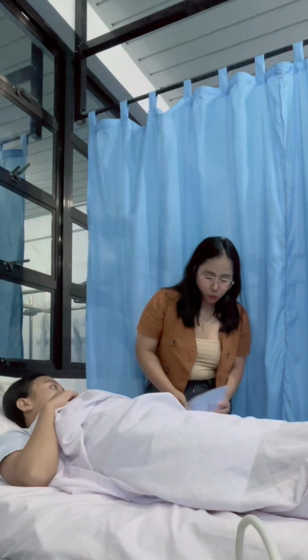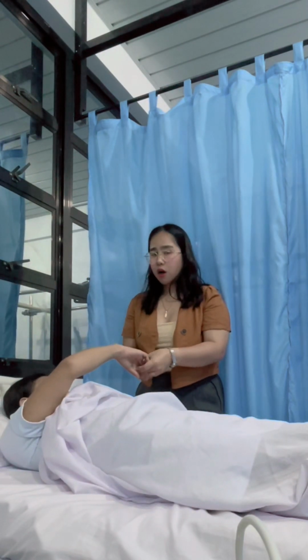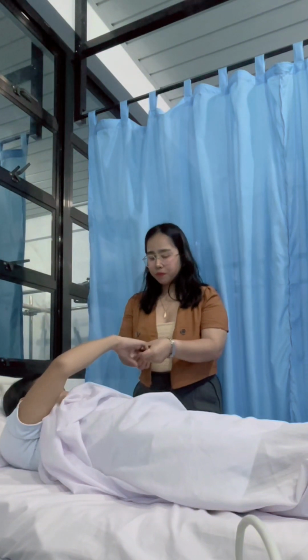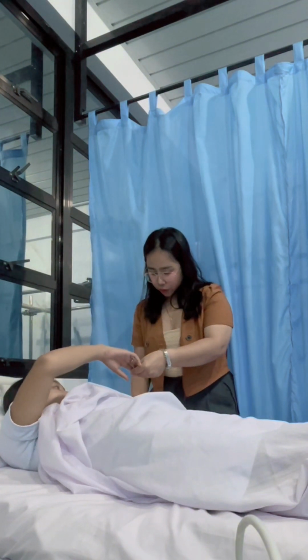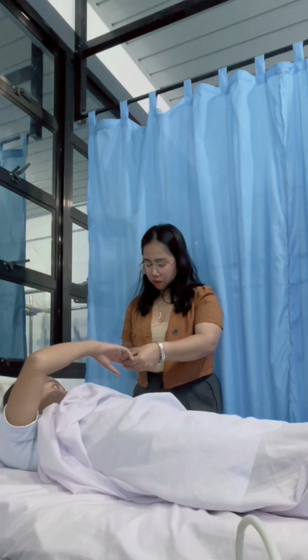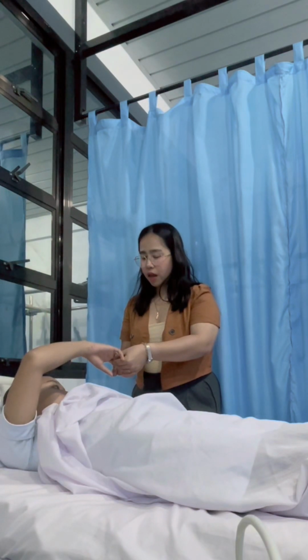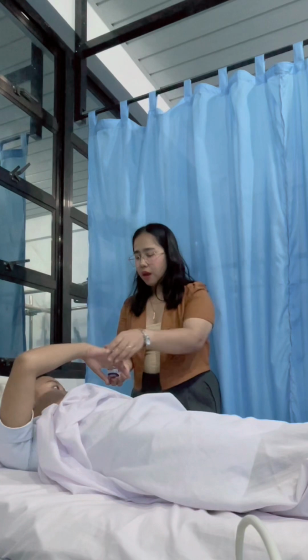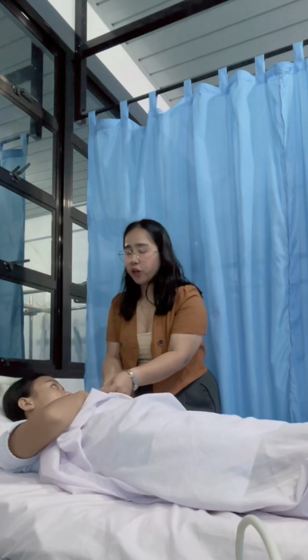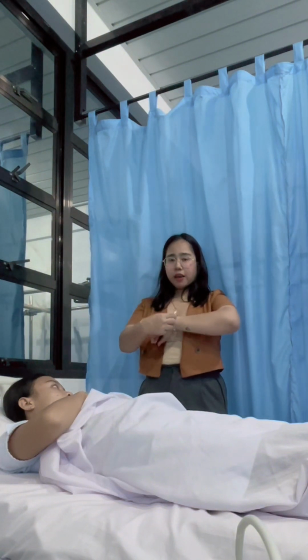The next, you need to clean the area where you're going to put the pulse oximeter. And then after you clean the area, insert the pulse oximeter on the index finger of the patient, and then put his or her hand over her chest, and then start counting her breathing for 30 seconds.